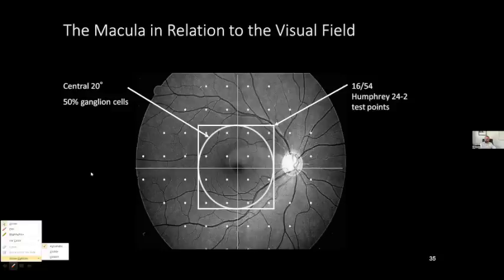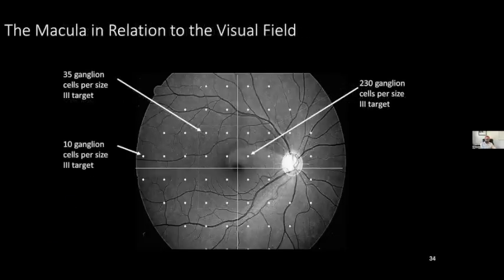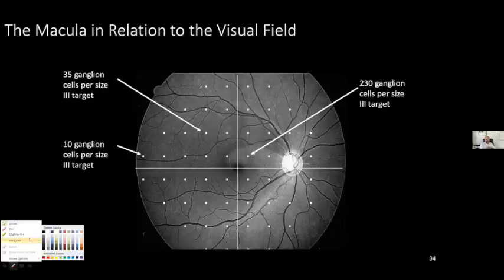The neuro-ophthalmologists usually do 30-2 when they started using the Humphrey visual field test and the Octopus. The 24-2 is mostly used by glaucoma specialists. You can say it's almost the standard of care for glaucoma follow-up. Basically, you avoid those very unreliable peripheral tests. It's not really peripheral, but peripheral tests. And the only extreme points you use are those related to the expected nasal step, because we know it's a very common, early pattern of defect in patients with glaucoma. So it's all about time, basically, if we want to simplify it.